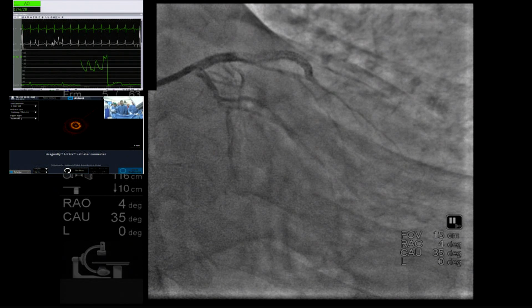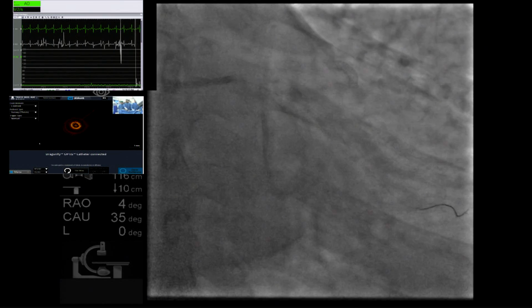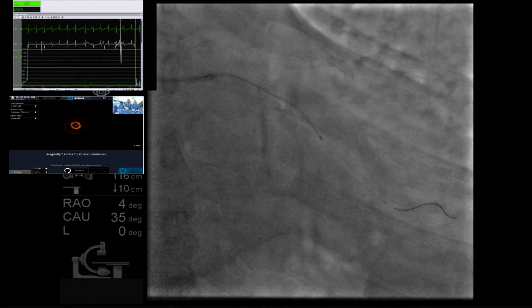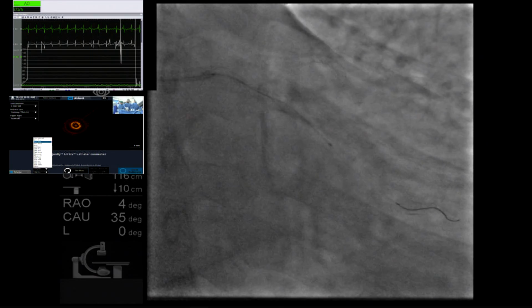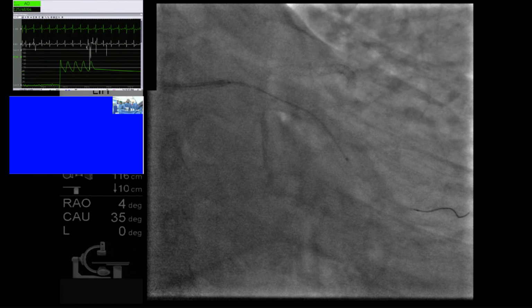Who else is there in the panel? And then I have a pro by my side. Aman is going to help me read the OCT as well. Yes, this is Akasaka speaking. Pre-PCI imaging is very important to decide how to treat, right? So we always do the imaging before PCI. Perfect. So we have Akasaka Sensei on the panel, and he's going to help us.